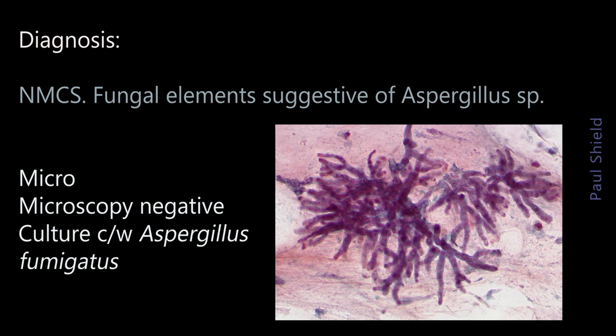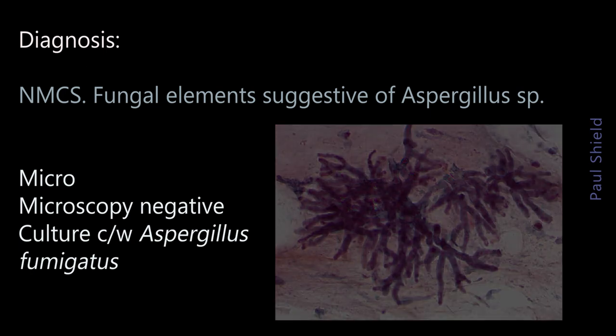You can also see fruiting heads in aerobic conditions, and the heads look a little bit like a brush, which is where the name comes from. An aspergillum brush was used apparently to sprinkle holy water.